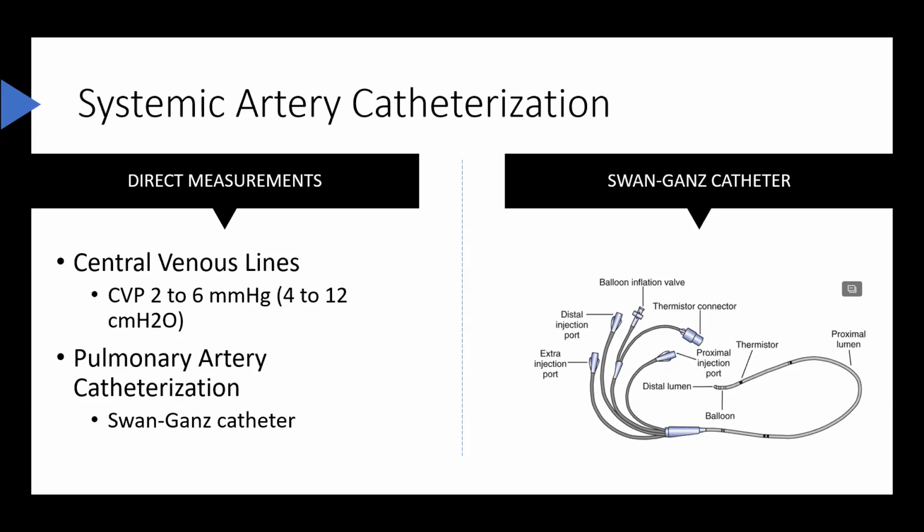Dual lumen catheters must have one lumen that connects to a balloon located near the tip of the catheter and a second lumen that runs the length of the catheter, terminating at a port at the distal end of the catheter. Triple lumen catheters have an additional proximal port that terminates approximately 30 centimeters from the tip of the catheter, or at the level of the right atrium. The third lumen can be used to measure right atrial pressures or for administering intravenous medications.